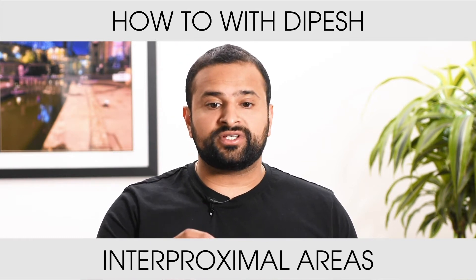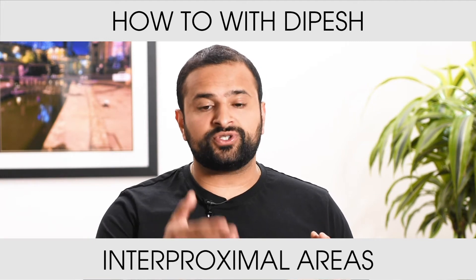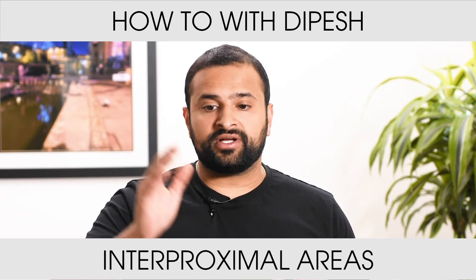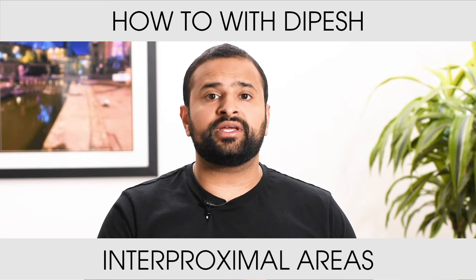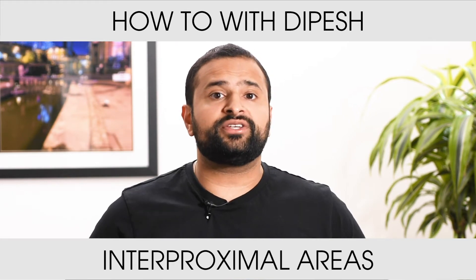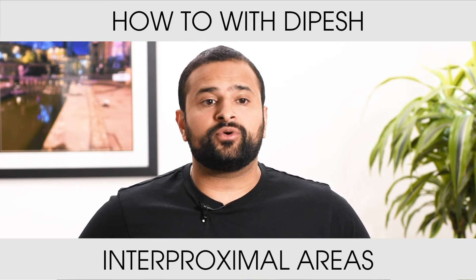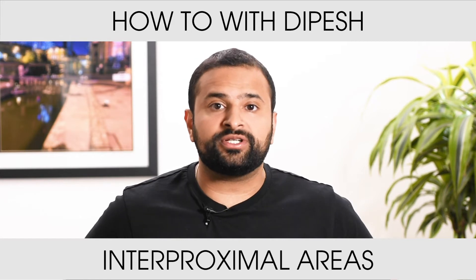So when you remove the matrix, you will have a palatal shell and you'll have an adjoining interproximal shell. That is your immediate interproximal wall builder.